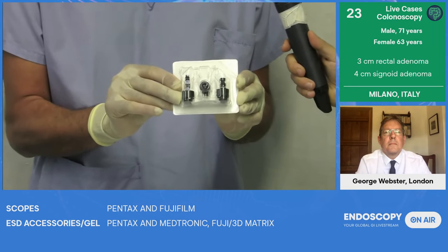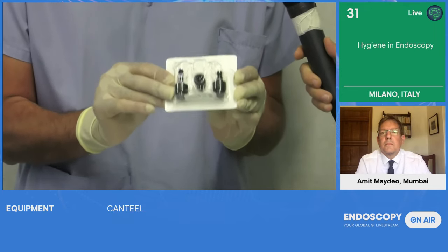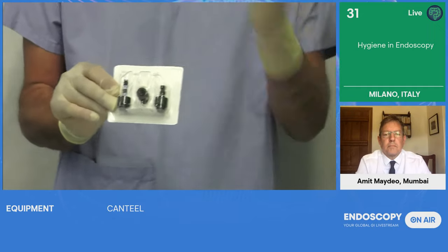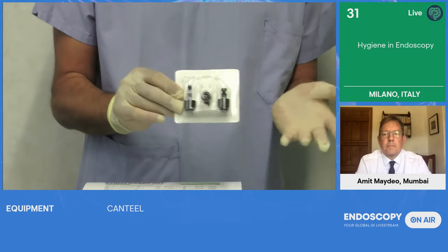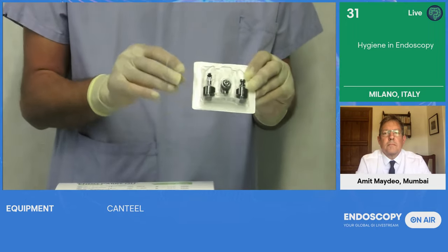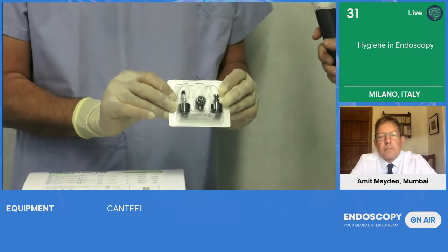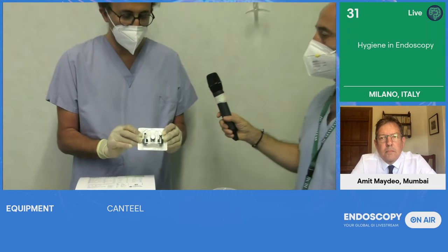And you know why? Because the contamination rate of the reusable valve is one of the points where reprocessing is corrupted. So if you do an ERCP in an immunocompromised patient, but even an upper or lower GI endoscopy, you need to be aware that this is a weak moment. So Cesare, there has been an Italian study we are particularly proud of about this. Can you tell us what the study was?